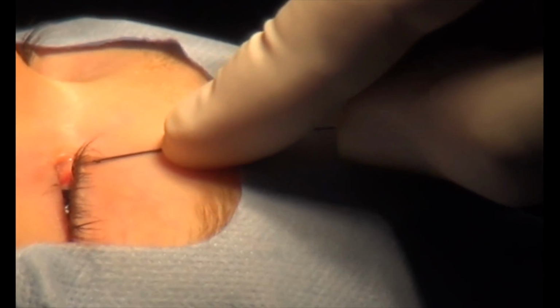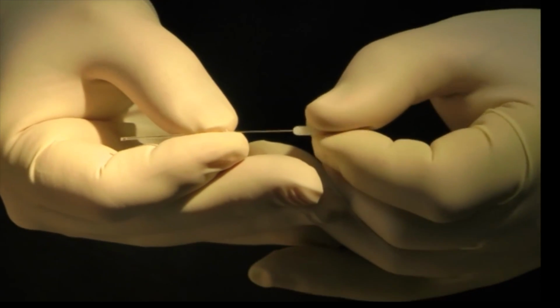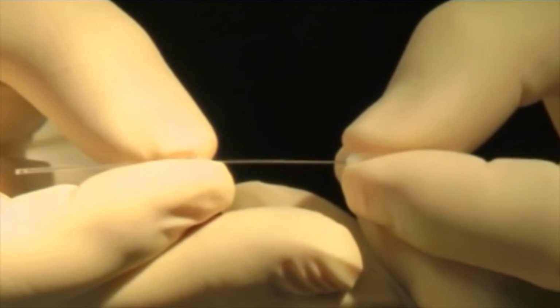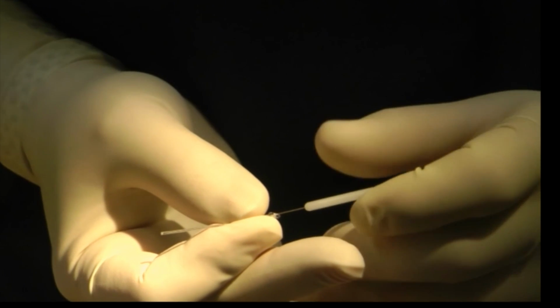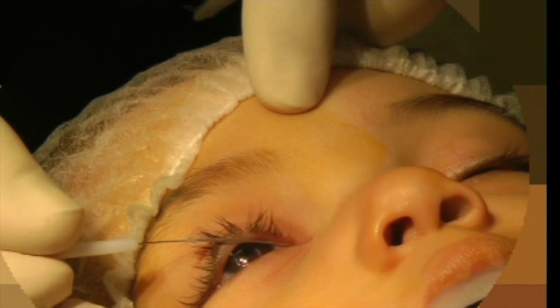The sizer is then removed, and one pearl to suggest at this point is for the surgeon to partially remove the metal introducer from the Masterka stent and lightly lubricate the introducer to facilitate its easy separation from the stent. Once lubricated, push the introducer back into place in the stent. The sterile Masterka is inserted through a dilated punctum into the canaliculus.